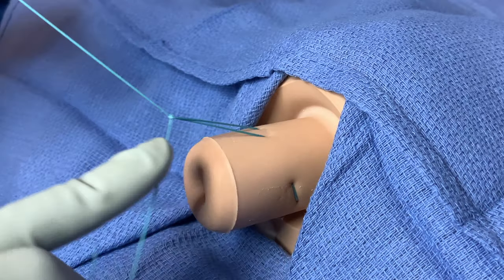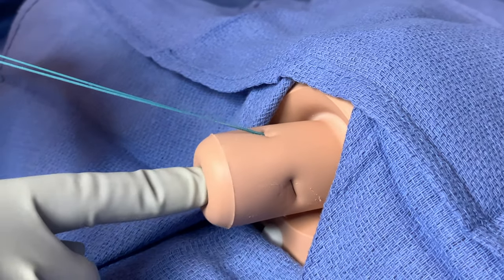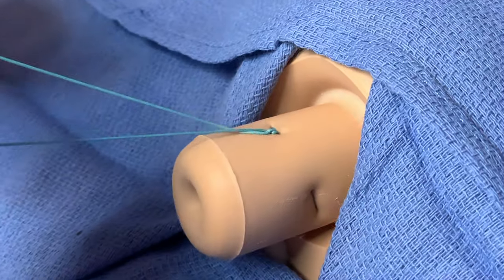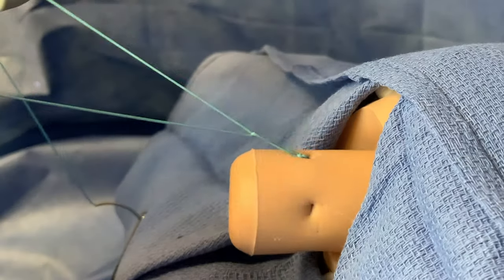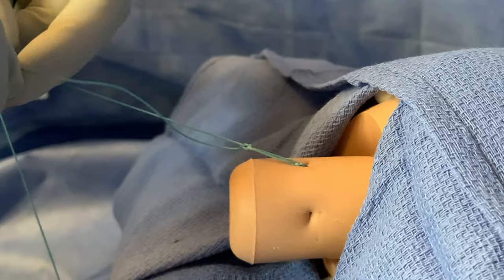Cinch the knot tightly to secure the cerclage. With an exam, ensure that the internal cervical os is closed and cannot permit a fingertip. Finish tying the suture. Before cutting the suture, leave a tail and tie an air knot for better identification when it's time for removal.